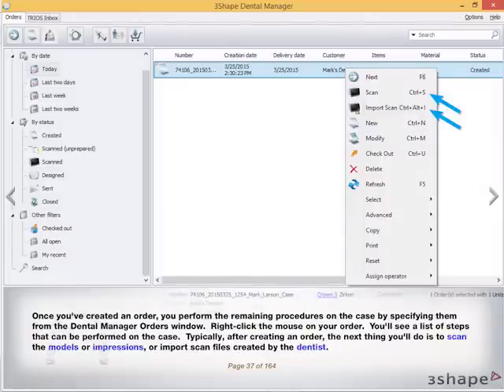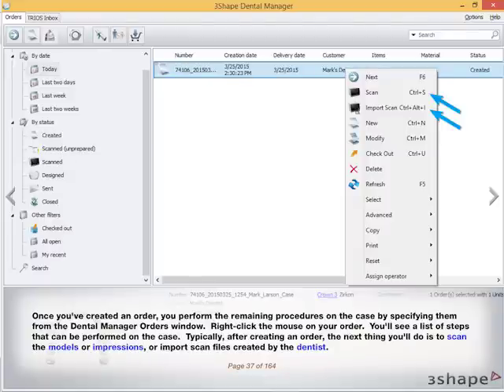For now, choose the white molar crown to create a full crown. Once you've created an order, you perform the remaining procedures on the case by specifying them from the Dental Manager Orders window. Right-click the mouse on your order and you'll see a list of steps that can be performed on the case. Typically, after creating an order, the next thing you'll do is scan the models or impressions, or import scanned files created by the dentist.